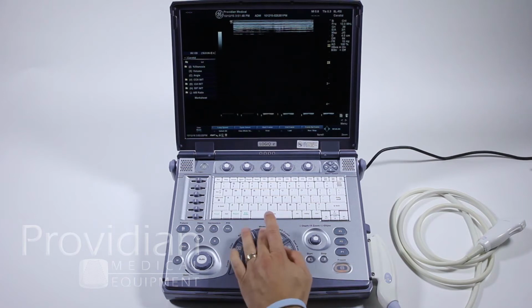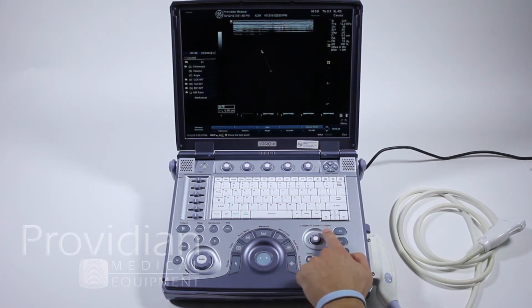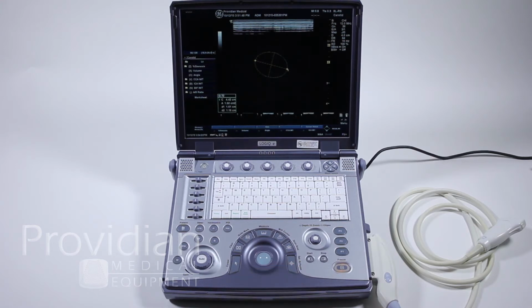For the ellipse, we're going to hit the measure key, set and draw the line, and then we're going to take this ellipse and build our ellipse this way. So we can stretch it, move it, press measure to continue to make our adjustments to go back and forth, and then set to save that measurement. I'll press clear to delete that.